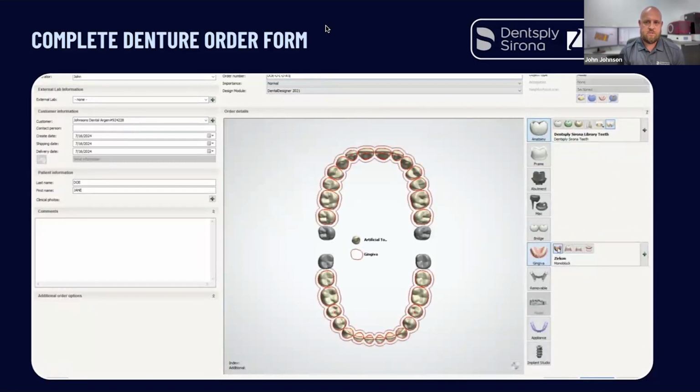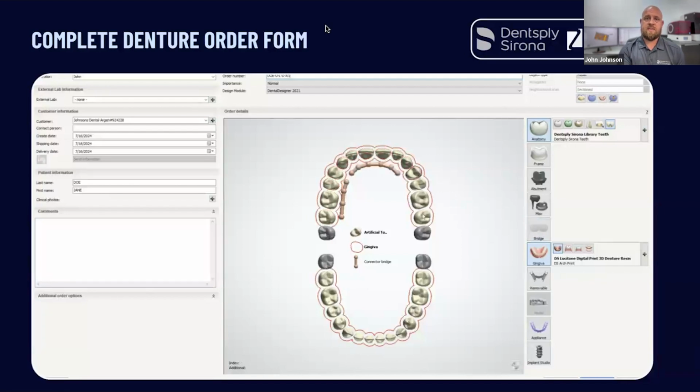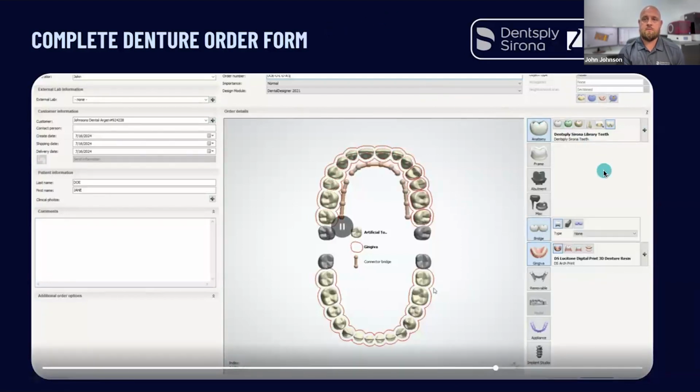So that's me showing you where the sockets are there. And now I'm selecting my LDP. And this is that bridging step. So I'm making that posterior quadrant, and you just have to click bridge. And that's it. And I'll do that around all the quadrants.